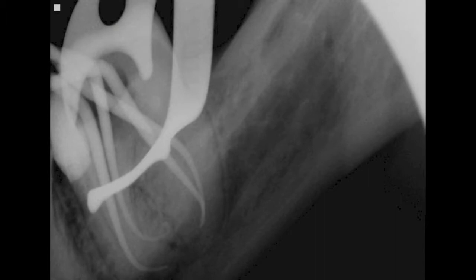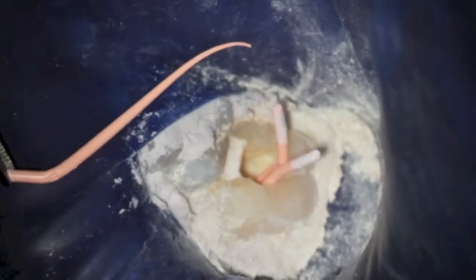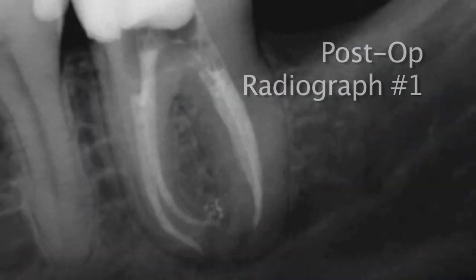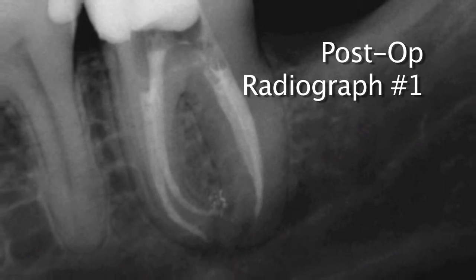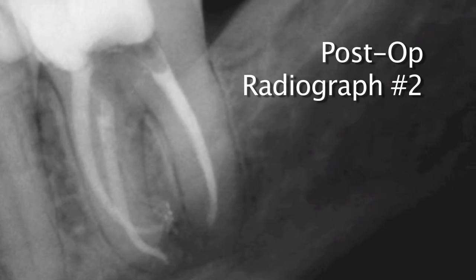You are now seeing a radiograph of my working image with gutta-percha cones in place at the predetermined working length. Take a look at the curve of this canal that is imparted to the gutta-percha point as it's removed from the canal. You will now see 2 final radiographs from this case, a straight-on and a shift film demonstrating the nice conservative shape the WaveOne reciprocating instrument achieves.